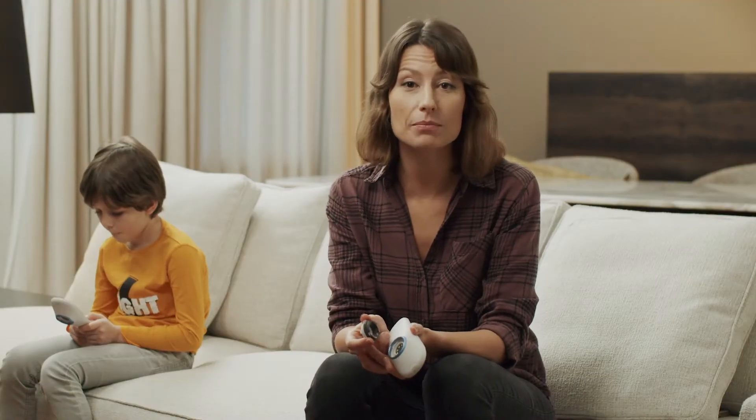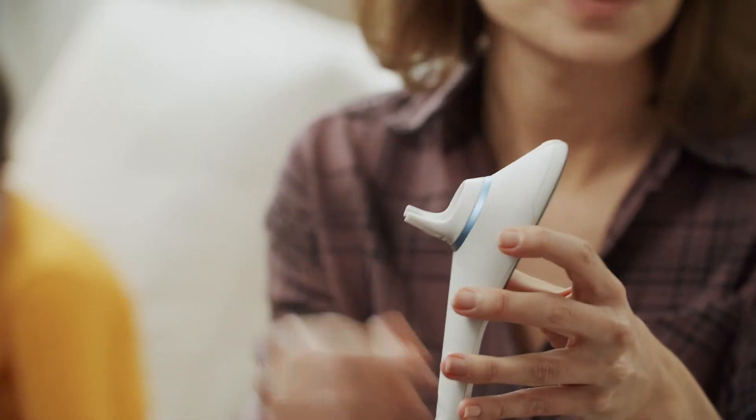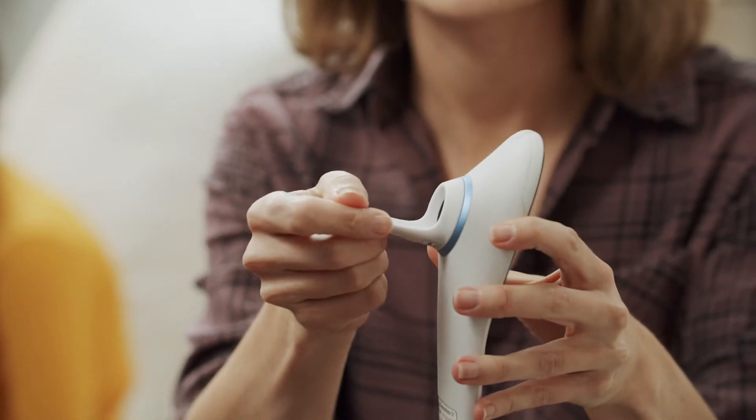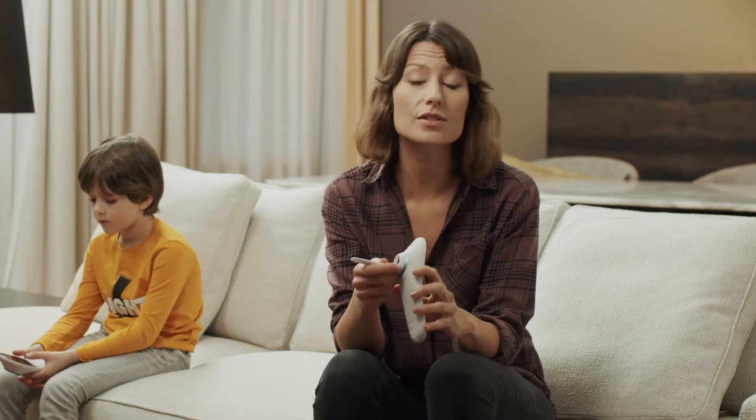Start the throat exam by attaching the module with the spatula. Make sure to choose the right size of the spatula. For children up to 5 years old, use a size S spatula.